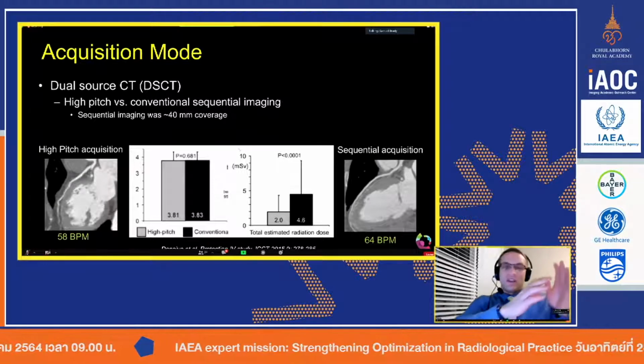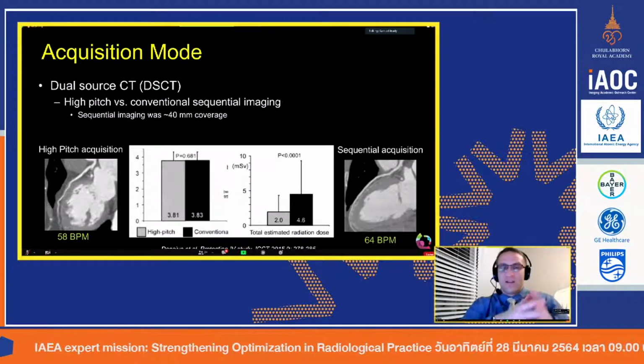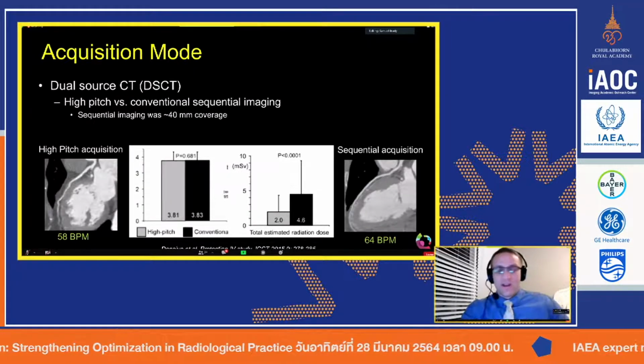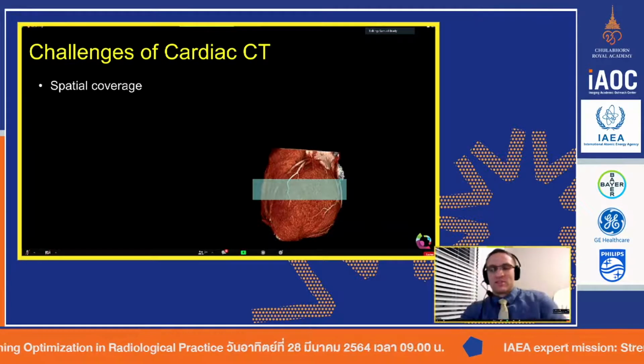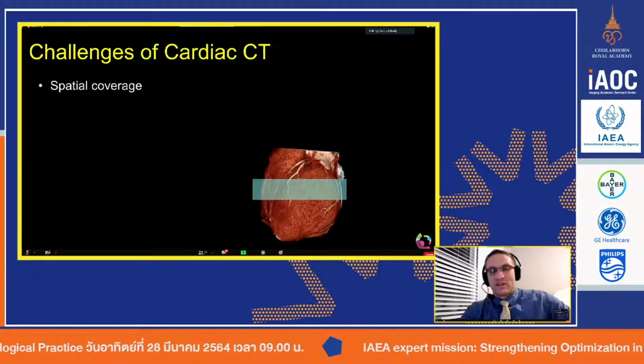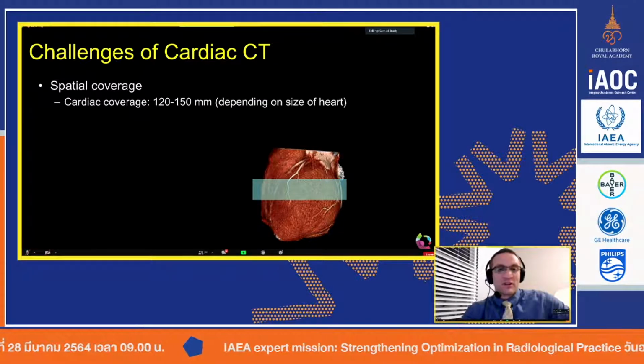So as you can kind of see, as we're moving forward, 2008, 2009, doses were higher. Now 2015, the doses are coming much lower. I think you're going to see that progression as we keep stepping through, that as we get farther and farther along in time, the technology is helping us get the doses much, much lower in the cardiac imaging.